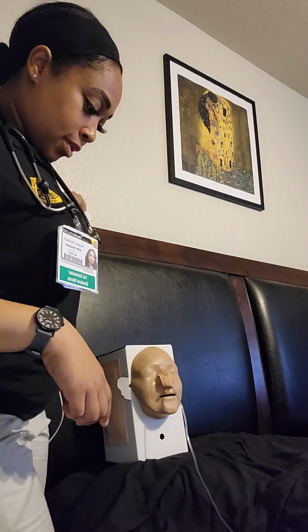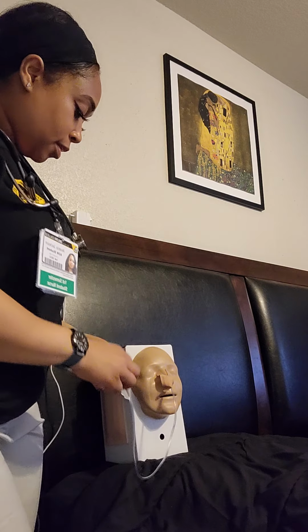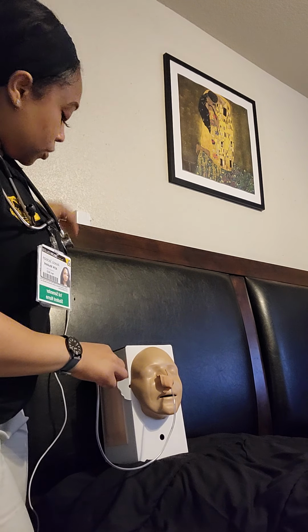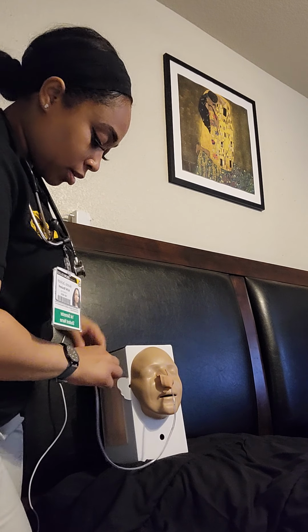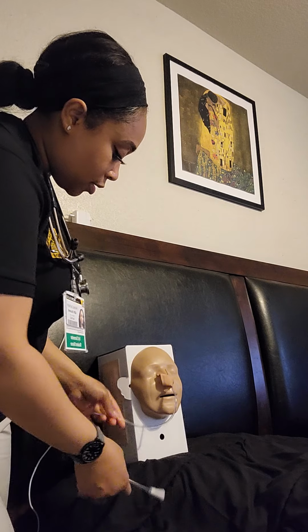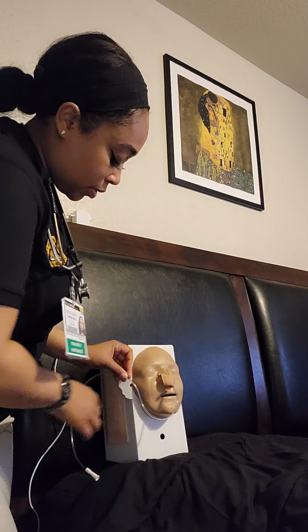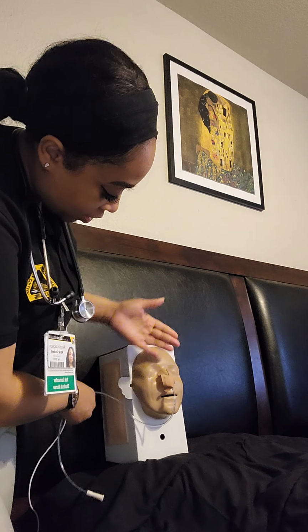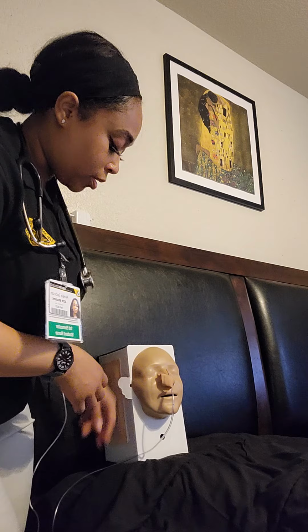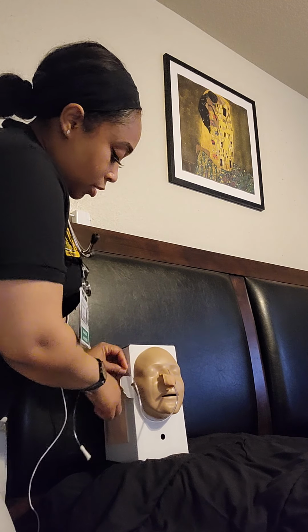Alright, once that is complete, I will disconnect the feeding. I will of course close off the tube just in case there's some leakage, but I will disconnect the feeding. I will go ahead and make sure the patient's NG tube is secure and they have the full range of motion of their neck. I will of course assess their skin, make sure there's no irritation. I can also add some skin protectant prior to applying tape and taping up the NG tube.